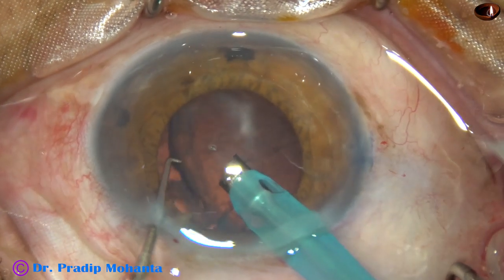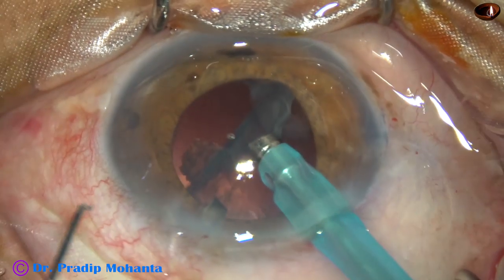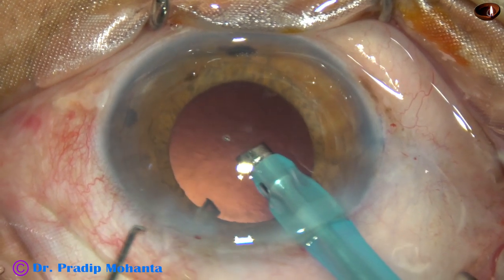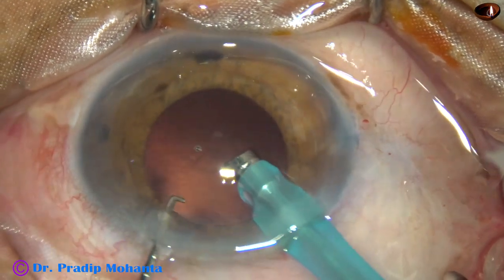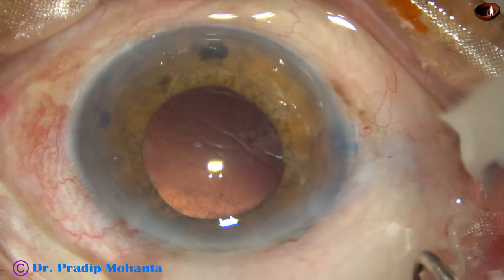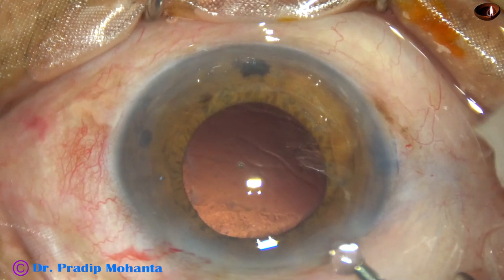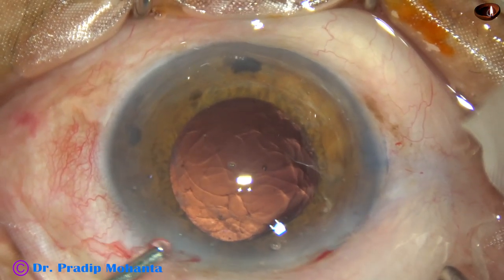This is a sheet of epinucleus. It is tilted and gradually emulsified with very low ultrasonic energy — say 5% ultrasonic energy. Nucleus is managed. Epinucleus is removed. Now some 2% HPMC is injected into the anterior chamber.